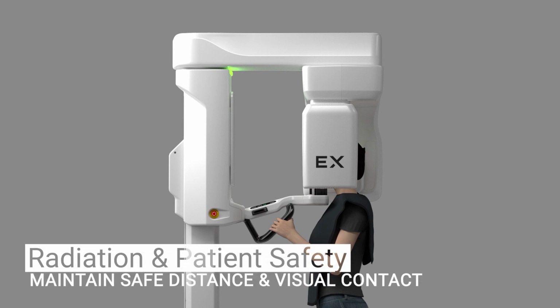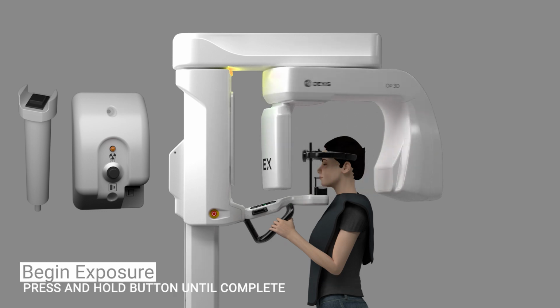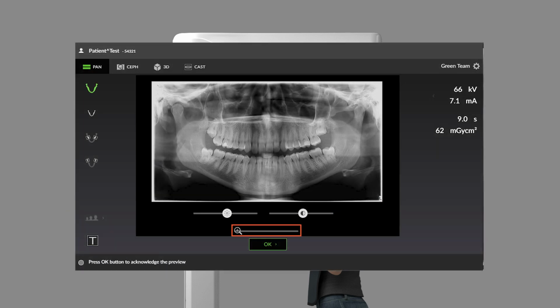Protect yourself from radiation in accordance with local safety guidelines and regulations while maintaining visual contact with the patient during exposure. Press and hold down the exposure button until the process is complete. The panoramic image will appear on the acquisition workstation for review. You can zoom, adjust brightness and contrast, or press the OK button to confirm image acquisition.